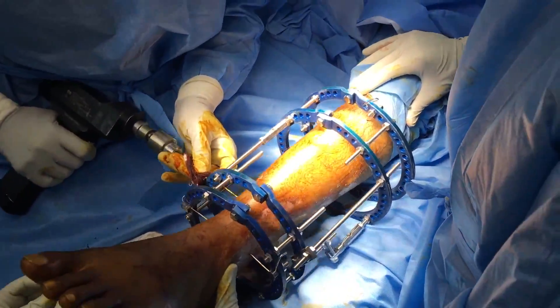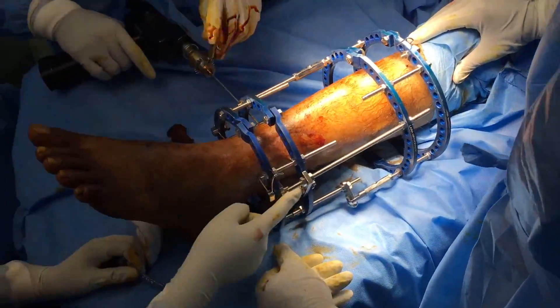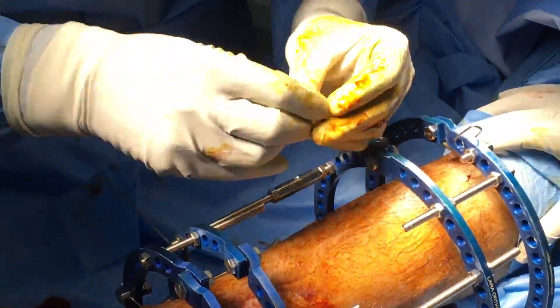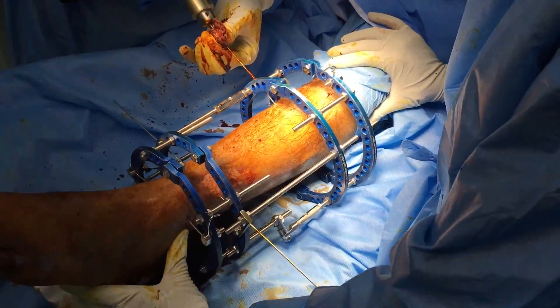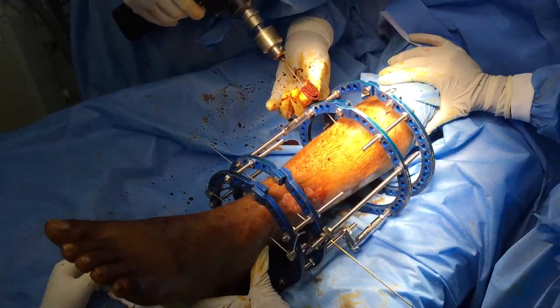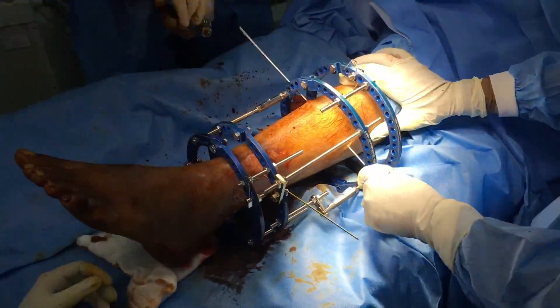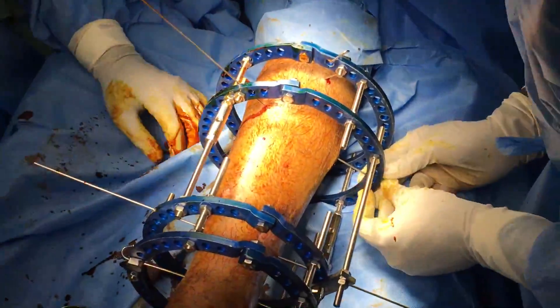The next two reference wires are parallel to the previous wires, but to ensure that we are able to move the frame in the medial-lateral direction should the need arise. The steps are the same — we pass the wire in the appropriate safe corridor, in this case in the medial-lateral axis, and tighten one end of the wire to the ring while we twist the nut on the opposite side.